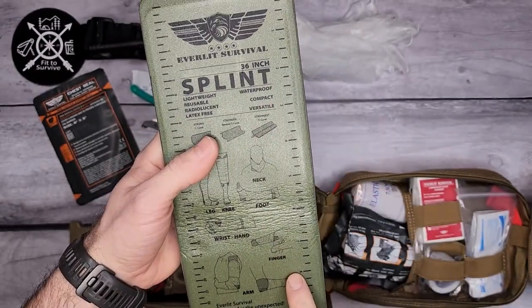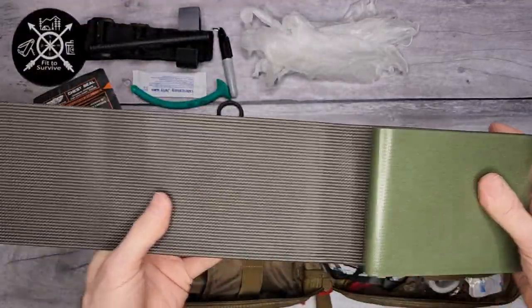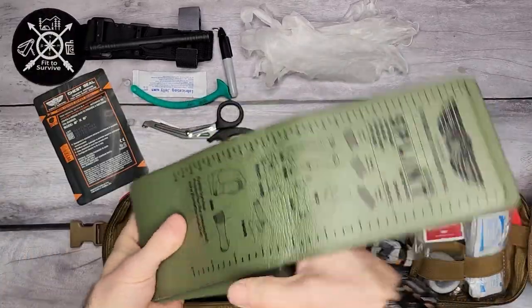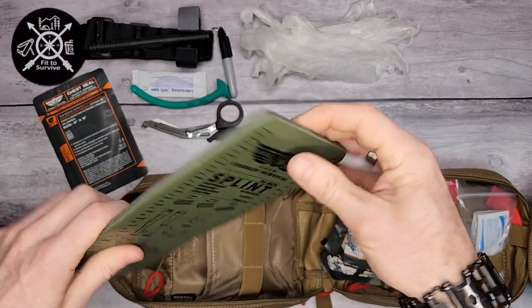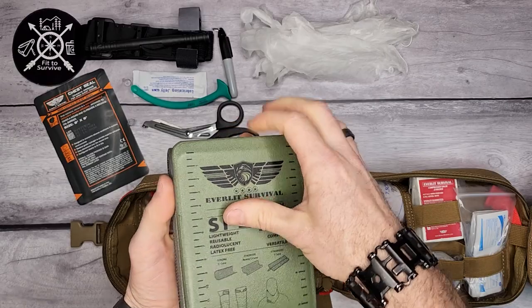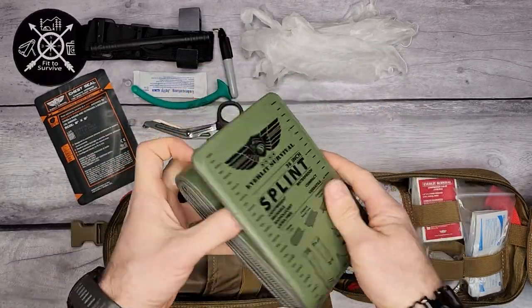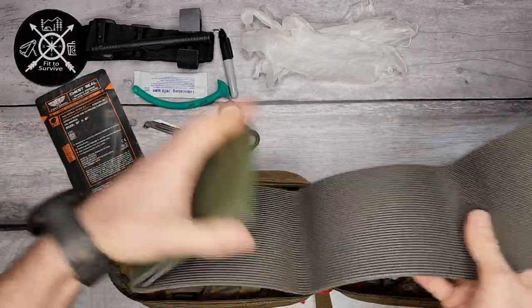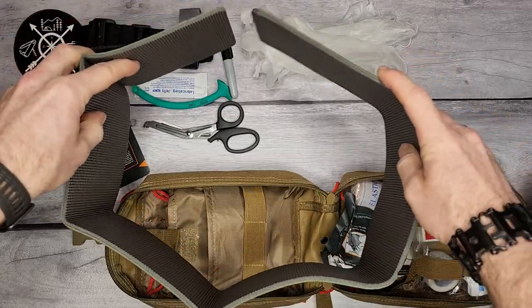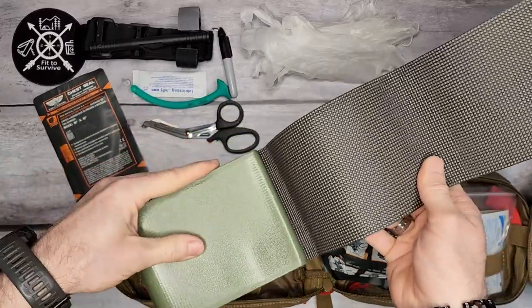It's great that they have all the instructions on there. The splint is basically aluminum metal on the inside for structure, with a soft foamy coating on the outside for comfort. You can conform it around a broken arm or any other area. This is a 36-inch one, so there's plenty of it to get around whatever section you need.